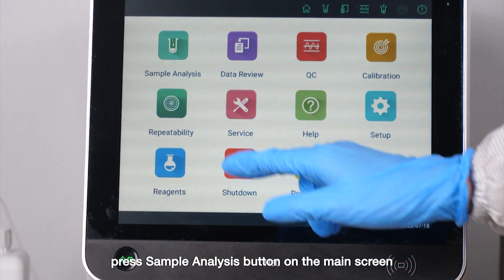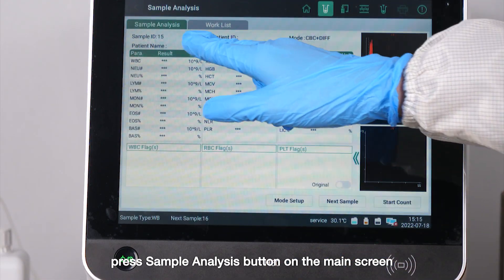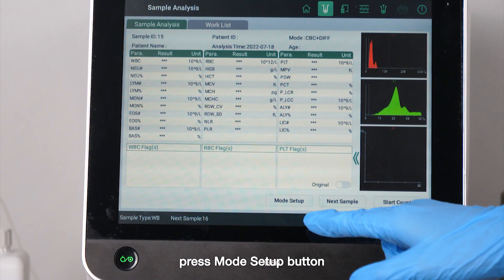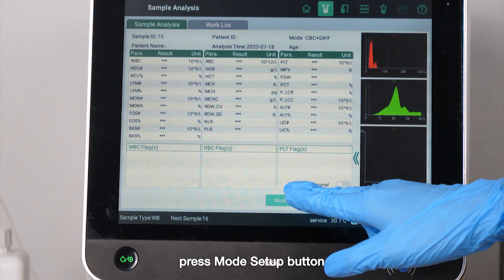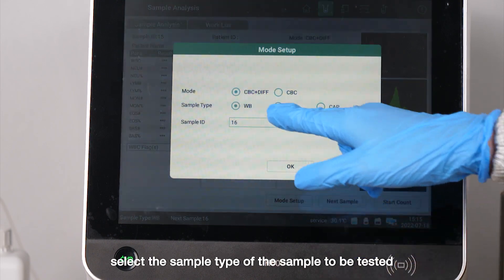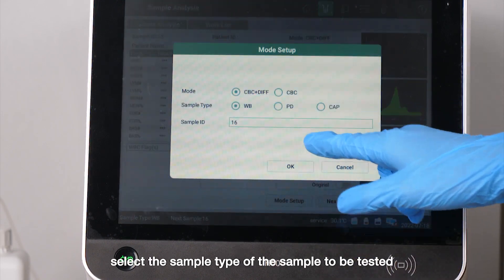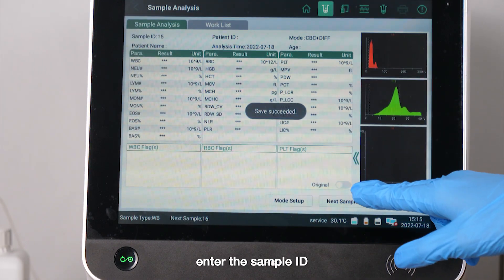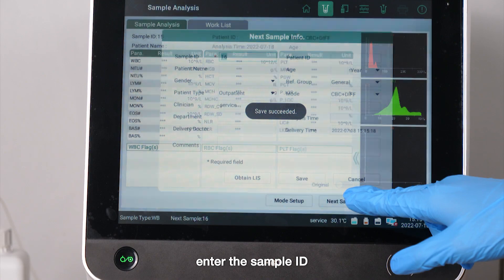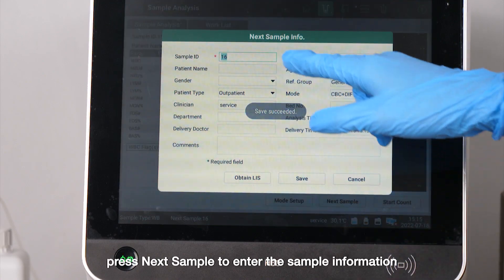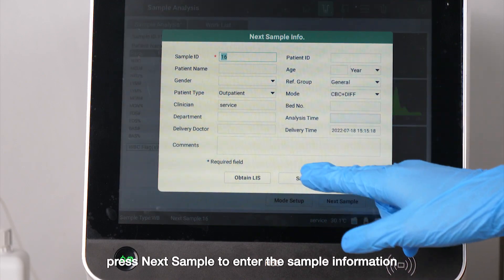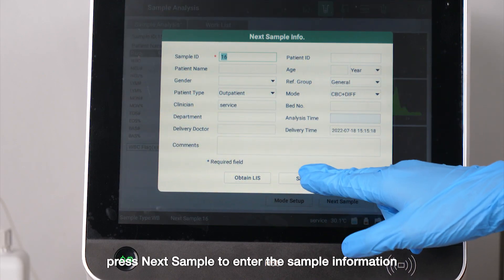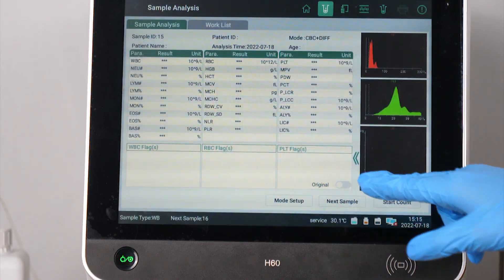Press the sample analysis button on the main screen. Press the mode setup button. Select the sample type of the sample to be tested. Enter the sample ID. Press next sample to enter the sample's information.